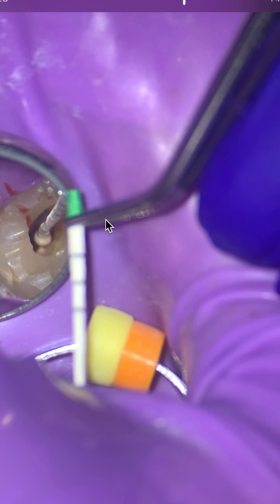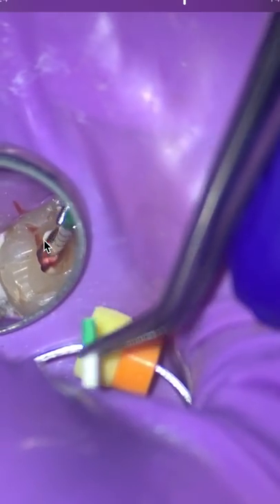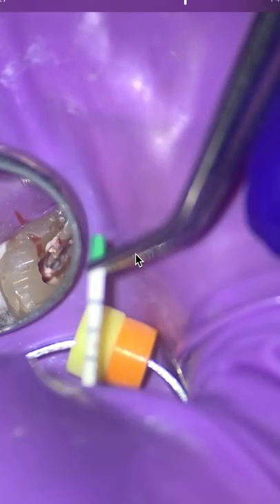So what I did is I took a radiograph and then I seared off. Say, for example, I place a gutta percha here, gutta percha here with sealer, take my x-ray, sear the canal off, pull this gutta percha out, and then I'd start rinsing it out with sodium hypochlorite. And I'm like, oh, the bleed has stopped. That's strange. So what I've learned is that this BC sealer, these tricalcium silicates, actually seem to have some sort of anticoagulant or coagulant mechanism, astringent properties. How about that?